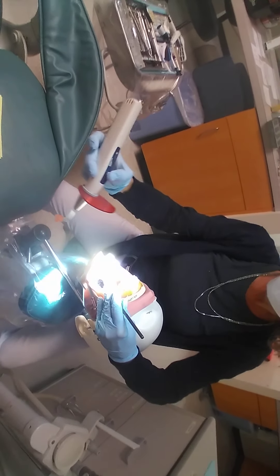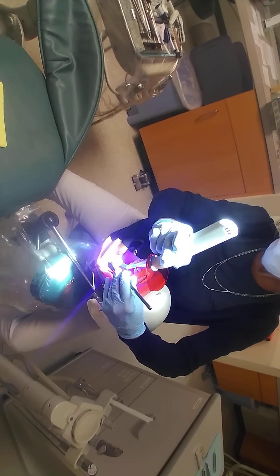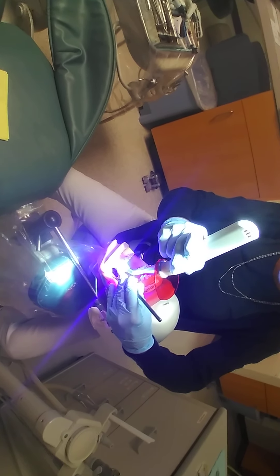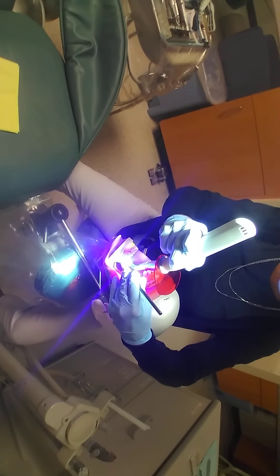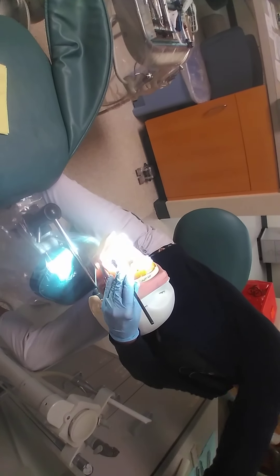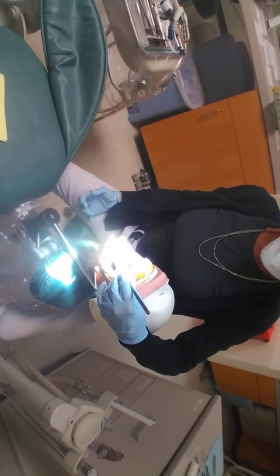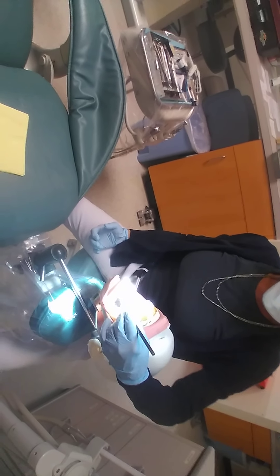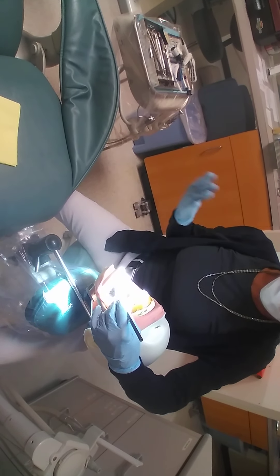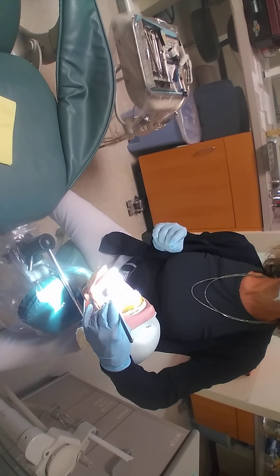I'm going to go around my patient's face and hold the curing light with a pen grip. I'm going to cure this for 10 seconds, making sure the angulation is 90 degrees so my wavelengths hit the pulpal floor perpendicularly. After 10 seconds, the unfilled resin is cured and I've created the hybrid layer — a combination of the dentin and the resin. That shiny, sticky layer I'm looking at is the oxygen-inhibited layer, which is uncured resin acting as my bonding agent.